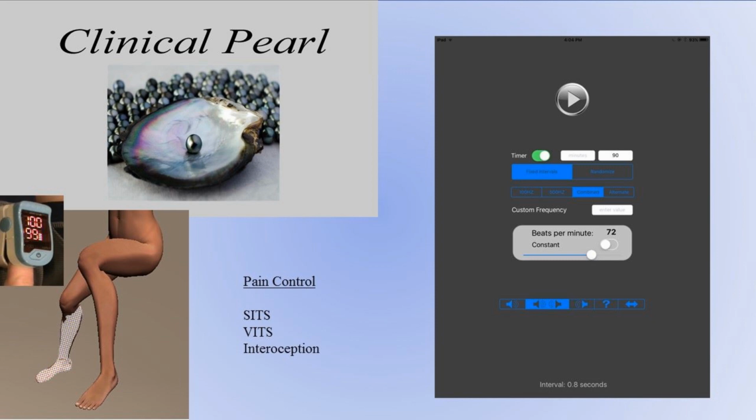This application deals with pain control using the tone pacer, and it's a very rewarding set of techniques. There's a little trial and error with this one. As far as frequencies, we typically use combined 100, 500, but we have found that some patients respond better to a higher frequency, for some reason, notably 2000 to 2500 hertz.